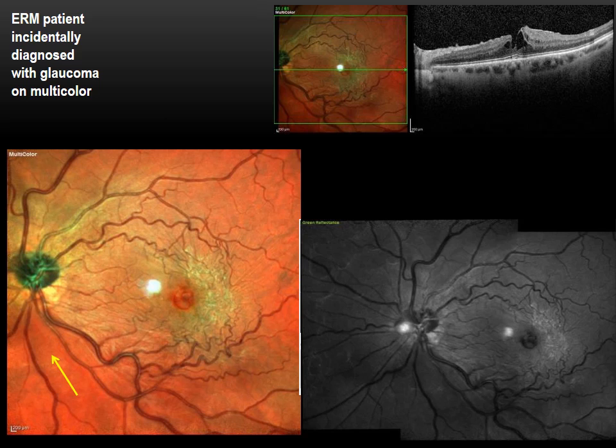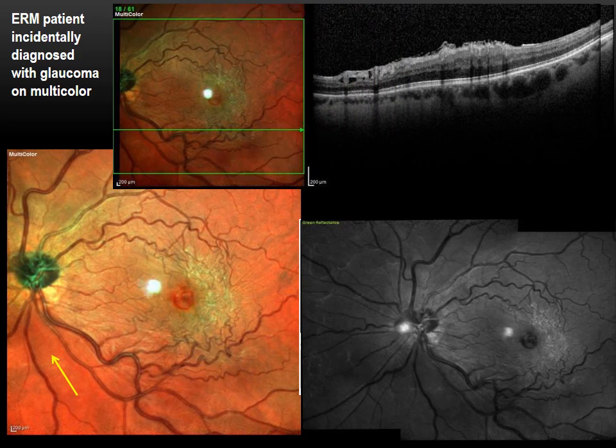And when one takes a cross section through that area, one can see the losses of the nerve fiber layer and ganglion cells in this region that is seen below the surface. But we would not know to look for these early losses had we not seen the multicolor image.